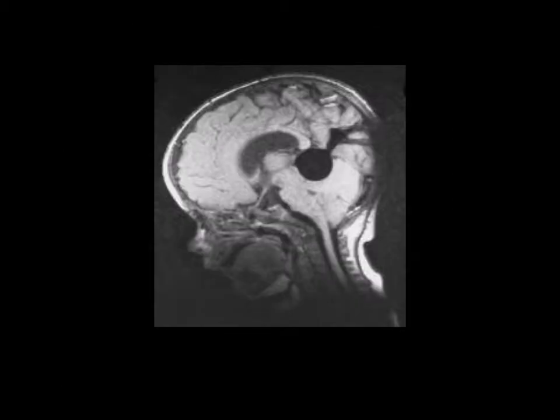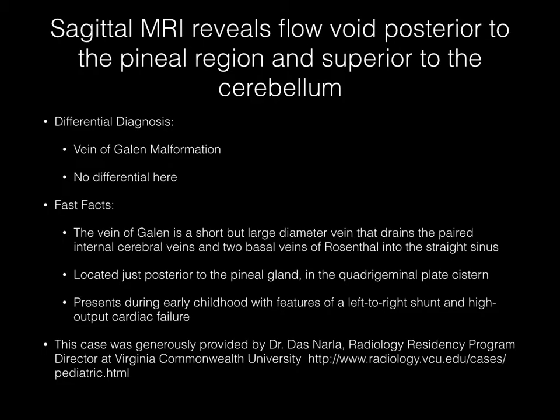Now pause your media player. This sagittal MRI image reveals a vascular flow void posterior to the pineal region and superior to the cerebellum. The diagnosis here is vein of Galen malformation. There really is no differential here.